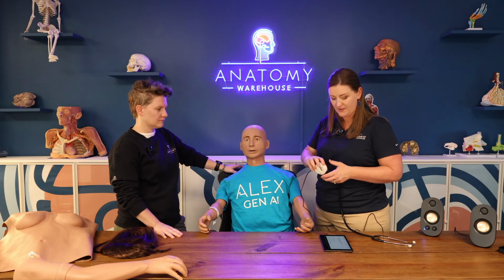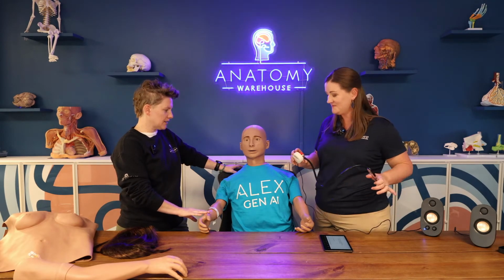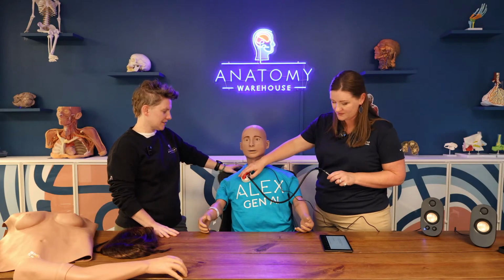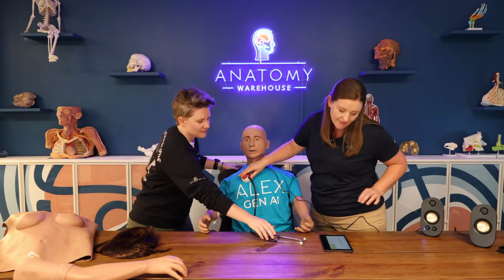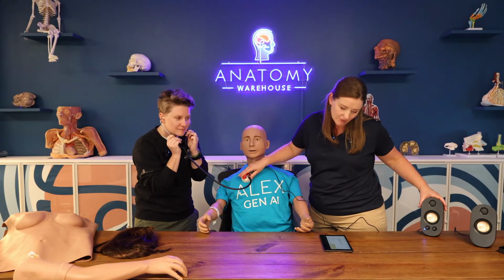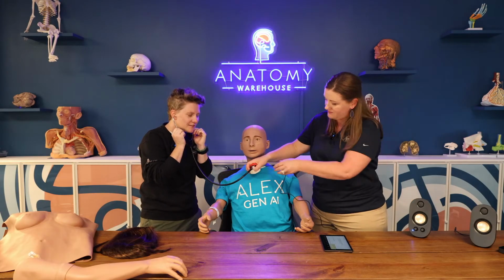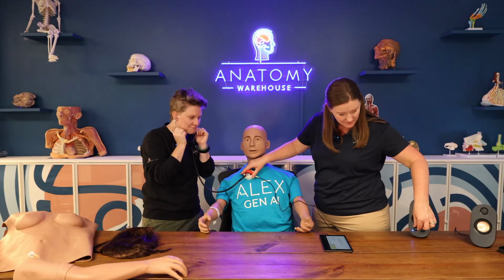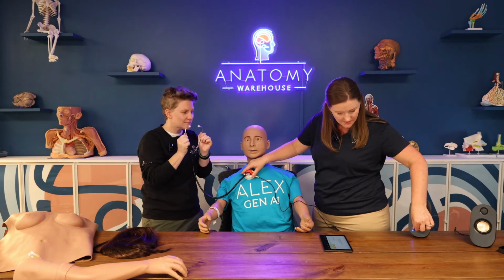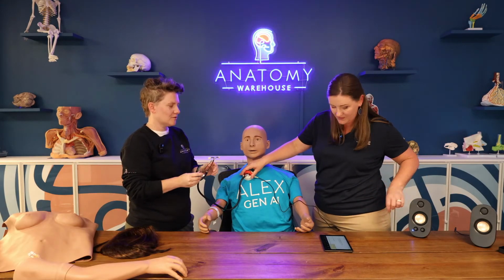It just plugs in there. I can definitely feel Alex's pulse, but let's listen to her breathing. As we're getting that on there, we are hearing the respiratory sounds. I can hear it in the stethoscope too. Can you hear it? Wonderful. Maybe it's not coming through the speakers quite as well. Oh, I can hear it a little bit. Oh, there it went.